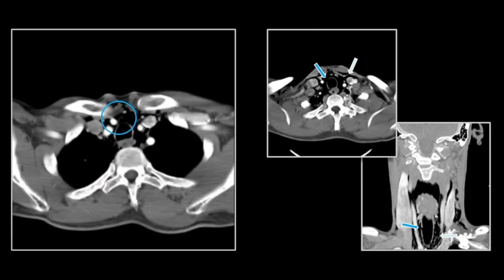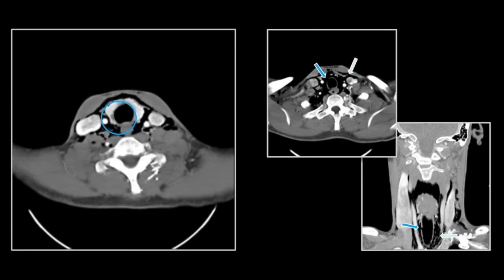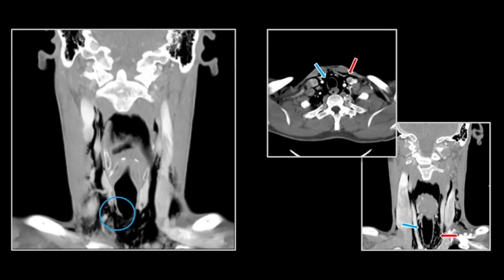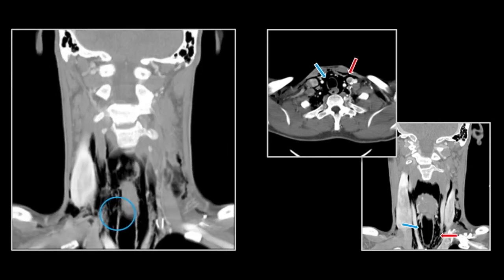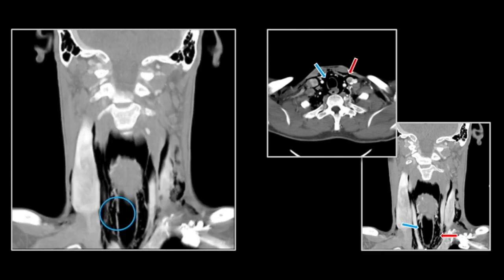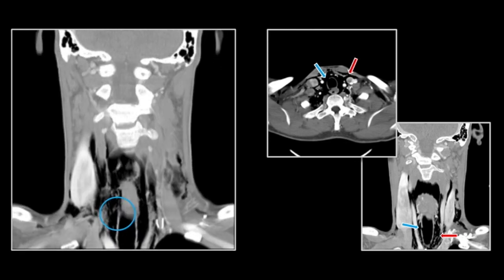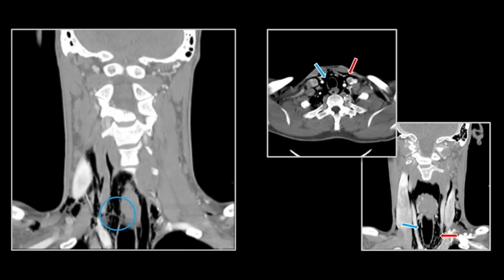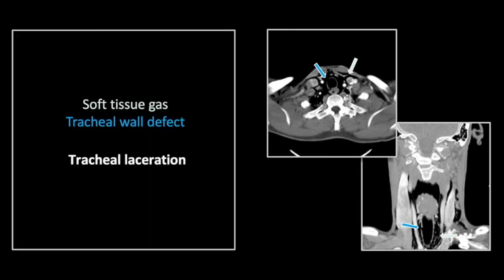There it is on the axial. Again, I encourage you to use lung windows and to view all orthogonal planes. There it is, shown very nicely on the coronals. So that is a tracheal laceration, a stabbing by a steak knife.